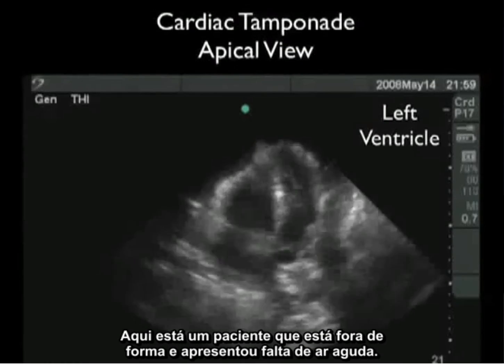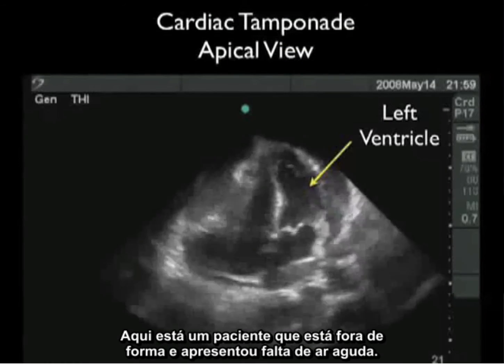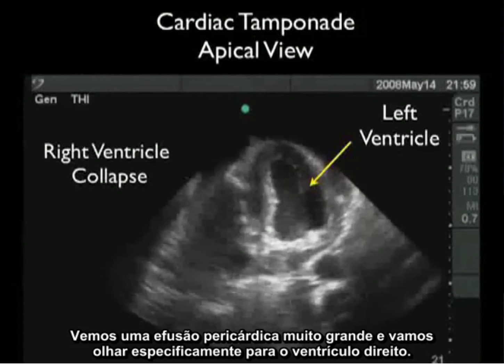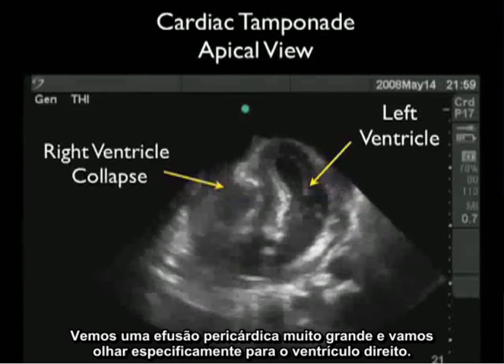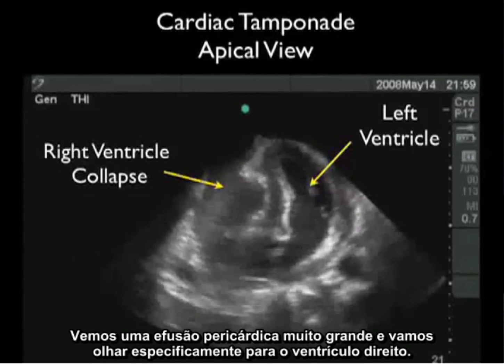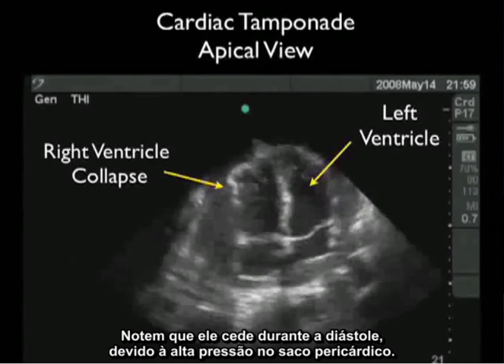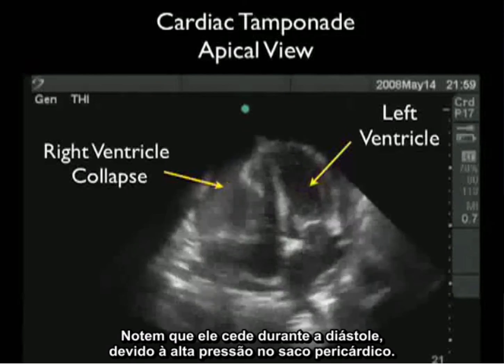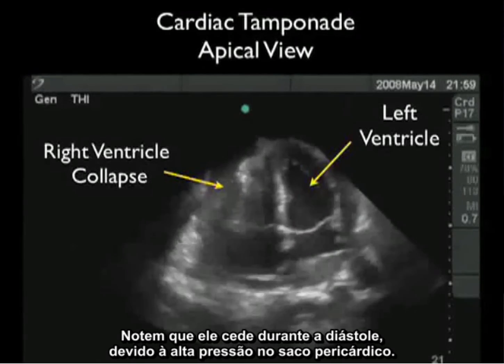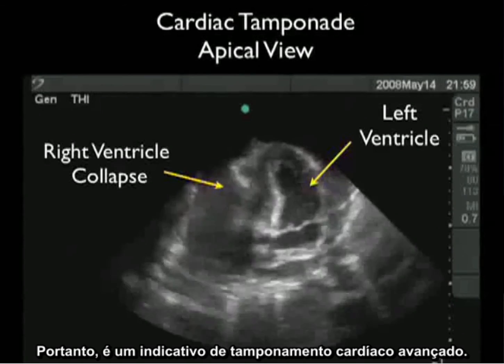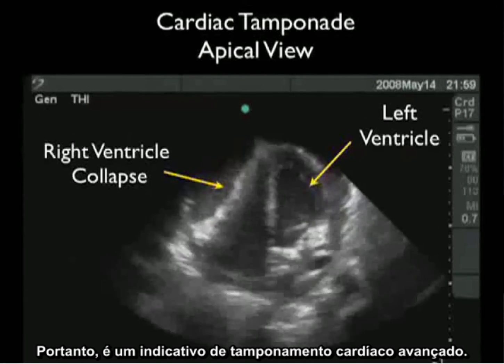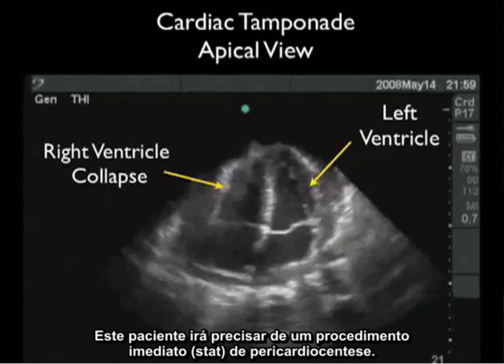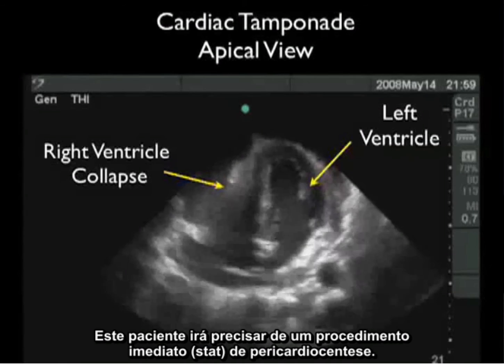Here's a patient who was in bad shape and presented with acute shortness of breath. We see a very large pericardial effusion, and let's look specifically at the right ventricle. Notice that it caves in during diastole due to the high pressure in the pericardial sac. This is indicative of advanced cardiac tamponade. This patient will need a STAT pericardiocentesis procedure.